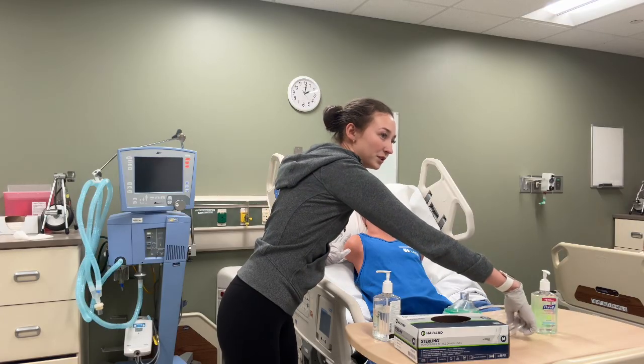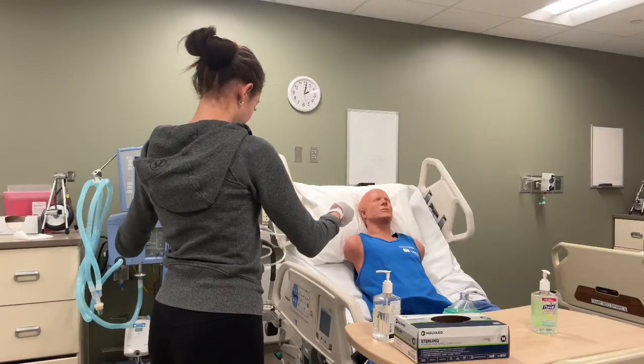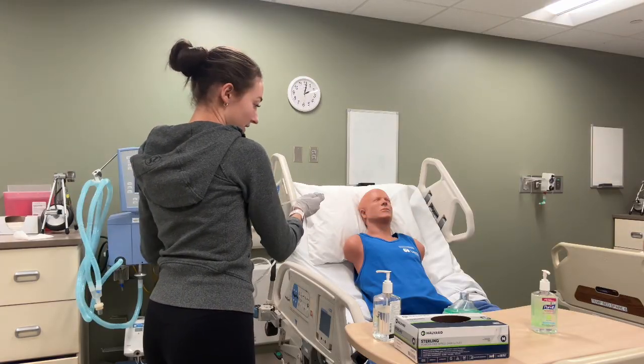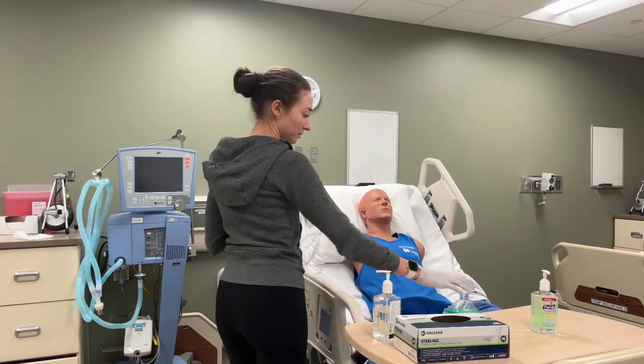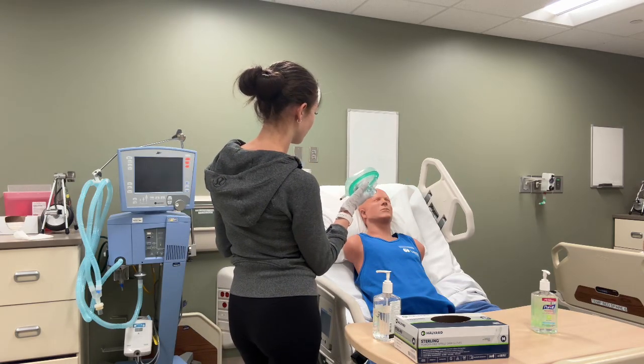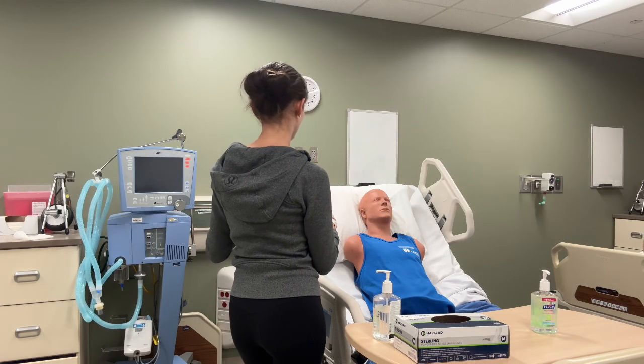And now I'm going to start the procedure of the EasyPath. It comes with a mouthpiece, but we are going to opt to use a mask instead because the mask allows for less of a leak so that you'll get the right amount of pressure.